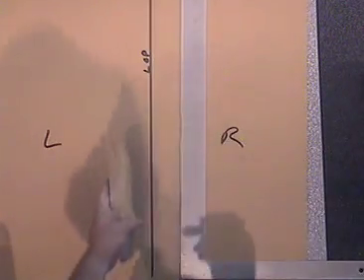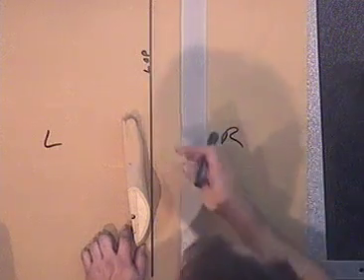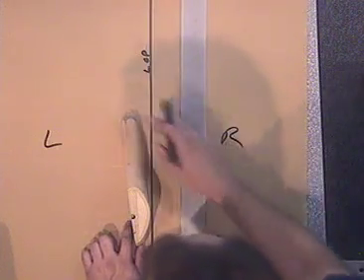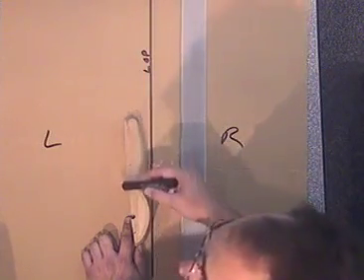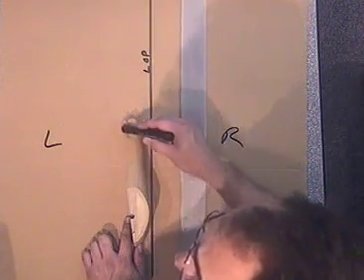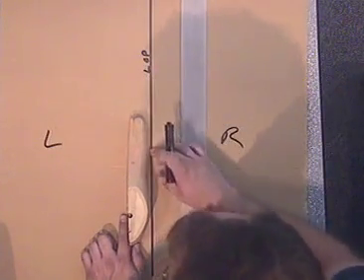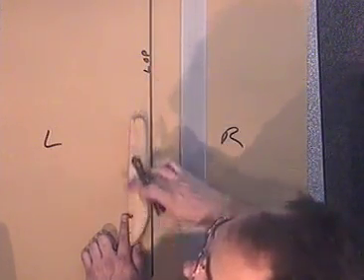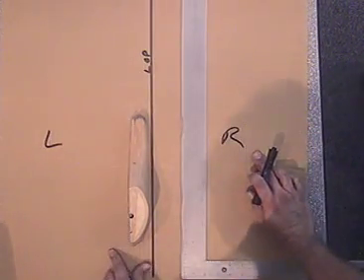So when I go to set my toe out, I'll use this prosthetic foot here. It's only half of a foot, but it'll work. This is the medial border of the foot. And this cut line that's cutting the foot in half here would represent the center of the foot. So if this is parallel with the line of progression, that would be 0 degrees of toe out. So that would be 0 like that.